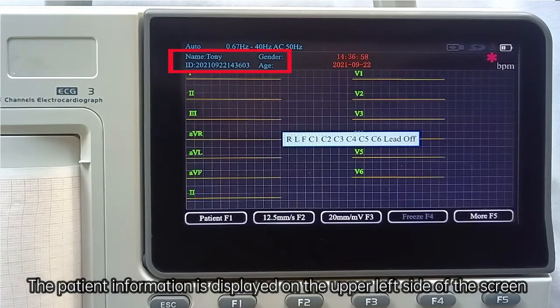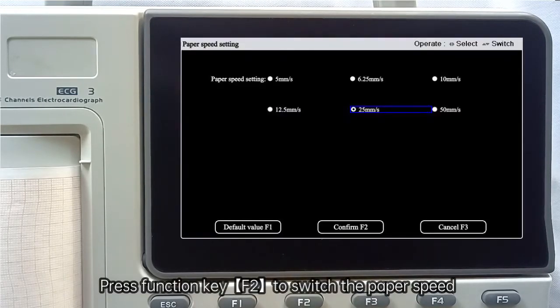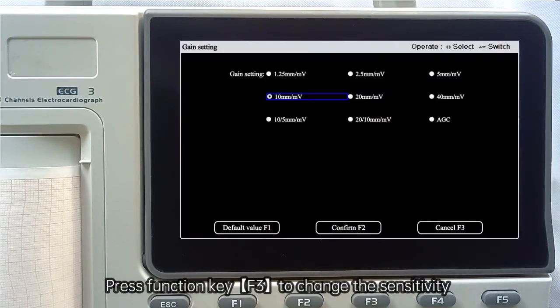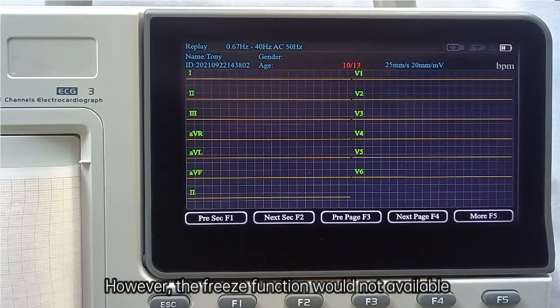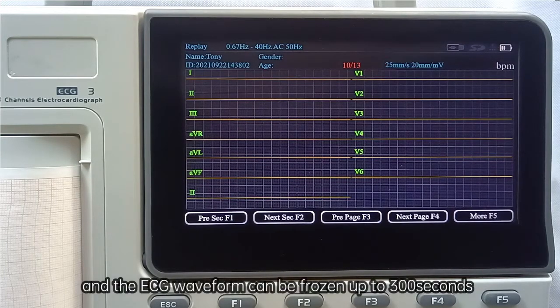Patient information is displayed on the upper left side of the screen. Press function key F2 to switch the paper speed; the default setting is 25 mm per second. Press function key F3 to change the sensitivity; the default setting is 10 mm per mV. Press function key F4 to freeze the current ECG waveform. Note that the freeze function is not available if ECG acquisition time is less than 5 seconds, and ECG waveforms can be frozen for up to 300 seconds.